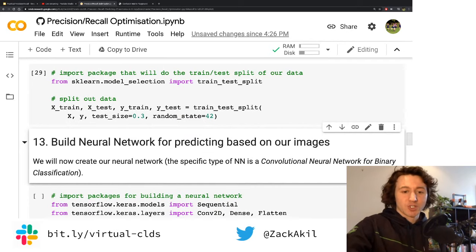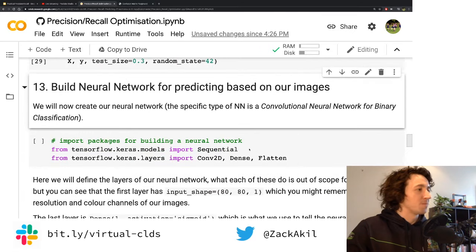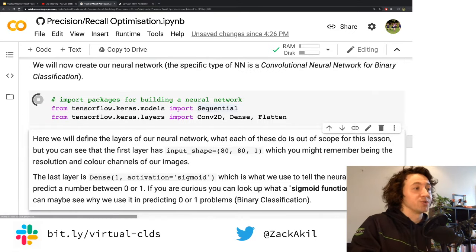And see if we've got any questions. Nope. We're continuing on. We're going to import the libraries we're using to build our neural network.